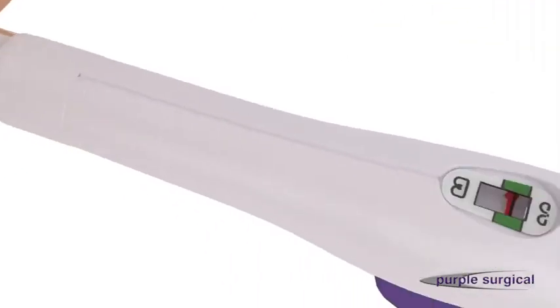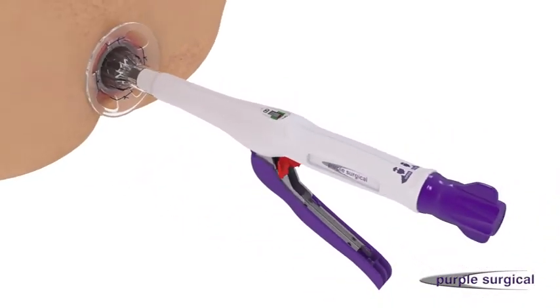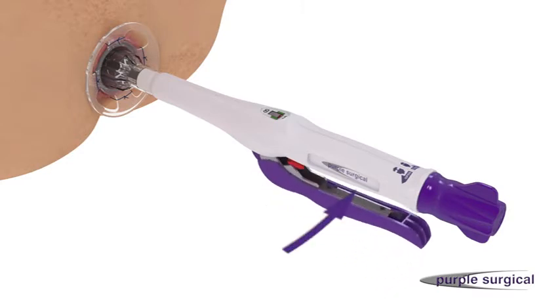Confirm the red line is in the middle of the green bar within the indicator window. Pull the red safety lever back until it seats into the body of the device. The stapler is then fired by squeezing the firing handle firmly in an upward direction.